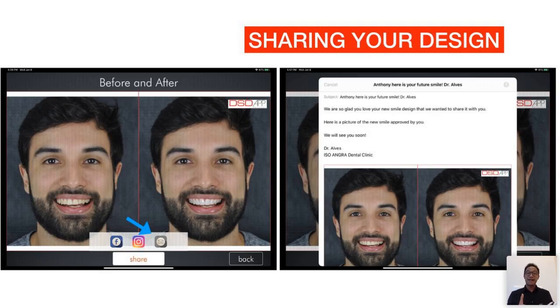And you're the doctor who has this digital technology that can do a facial analysis in order to create a harmonic smile for that patient. And the patient will love it.